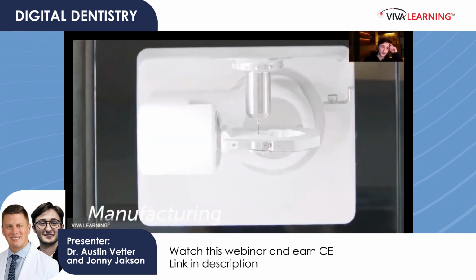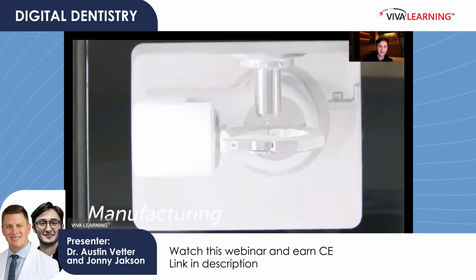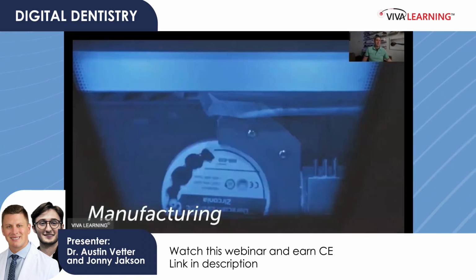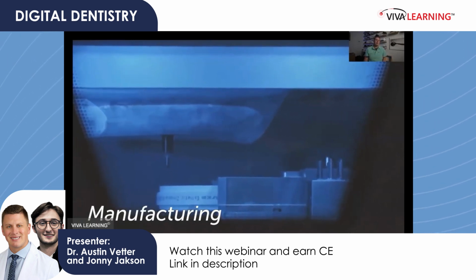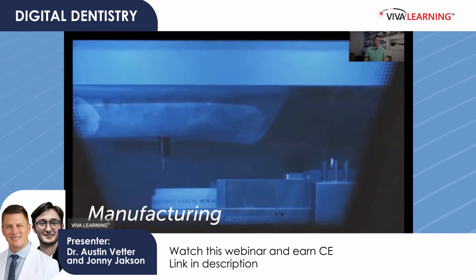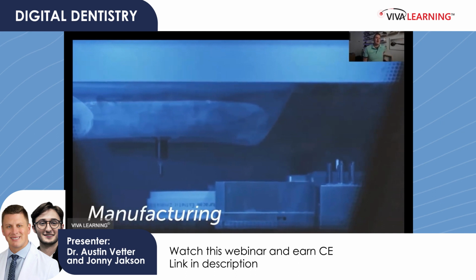Yeah, you have Exocad, even though you use 3Shape a lot. I still send you guys the Dental CAD scenes just in case you ever want to open them. No, and I love it. We've taken them and made models, and maybe we needed a model or something, so instead of having to get back to you, we can just make it because we have a minimal understanding of the software. So yeah, that workflow has been pretty cool, having both of us have the same software.